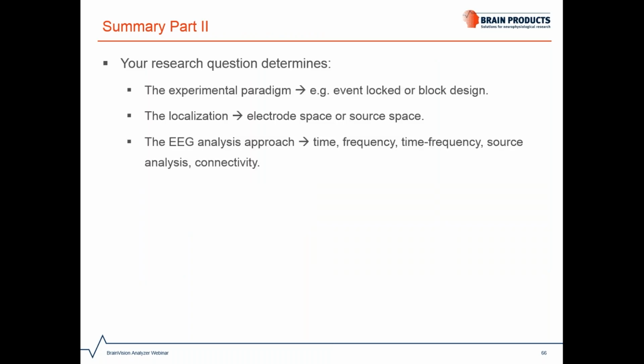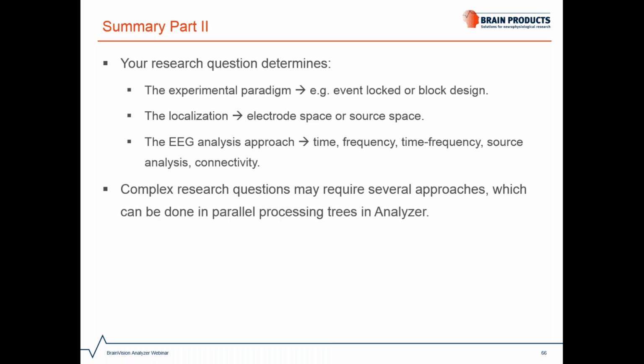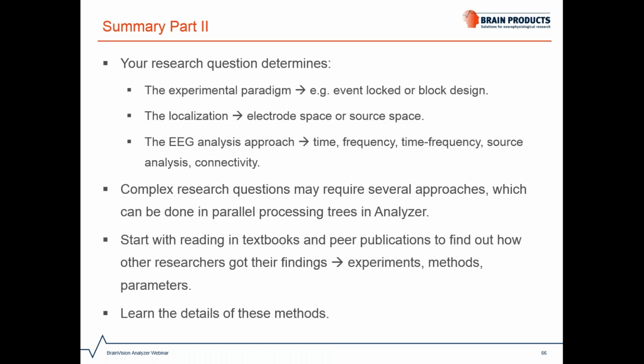Your research question determines the experimental design, may it be event-locked or in a block design. You should consider whether to work on electrode signals or do source localization. And it determines the analysis approach to be used. More complex research questions may even require several approaches, which can easily be done in parallel processing trees in Analyzer.